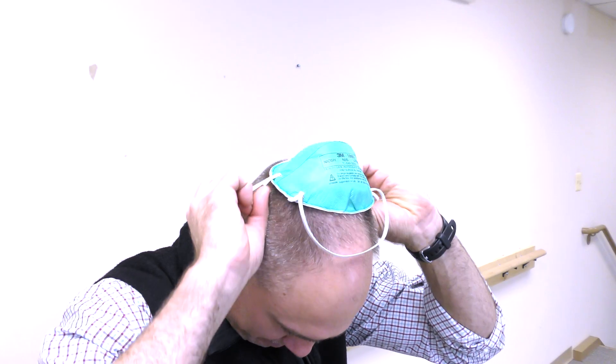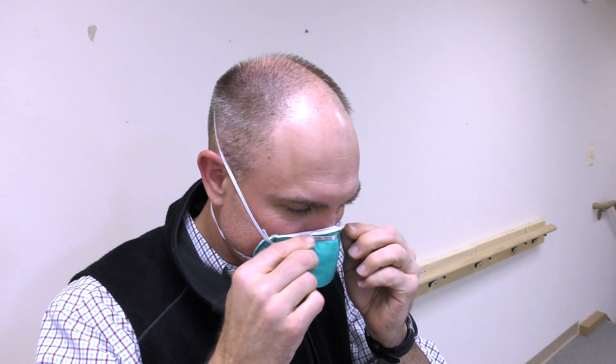You know you have fitted the mask properly if it becomes noticeably more difficult to breathe in and out due to the increased airway resistance provided by the mask. This is normal and is supposed to happen.